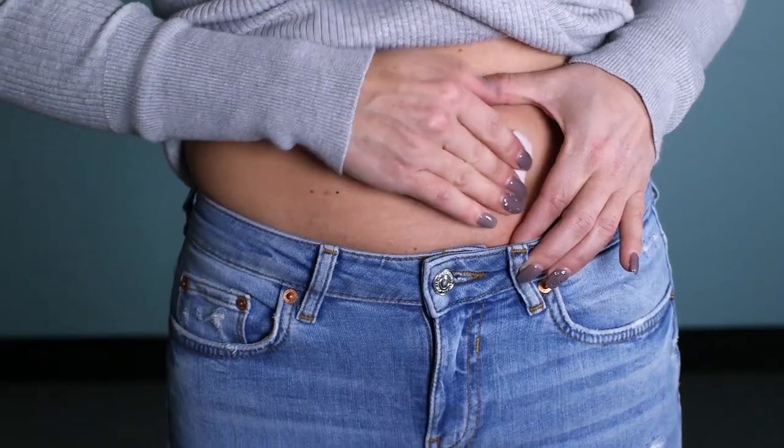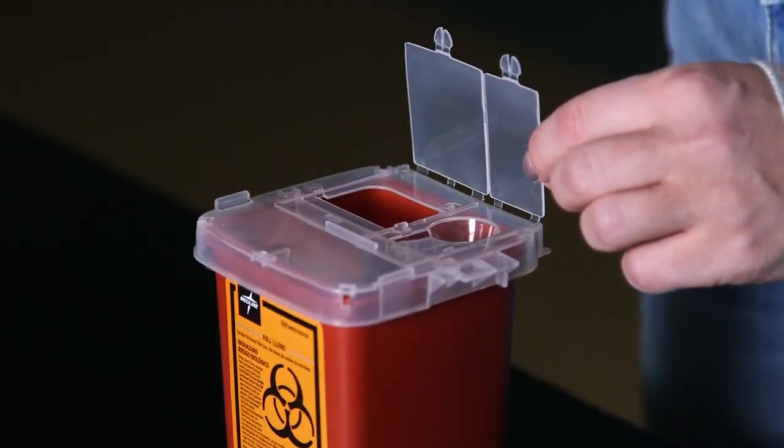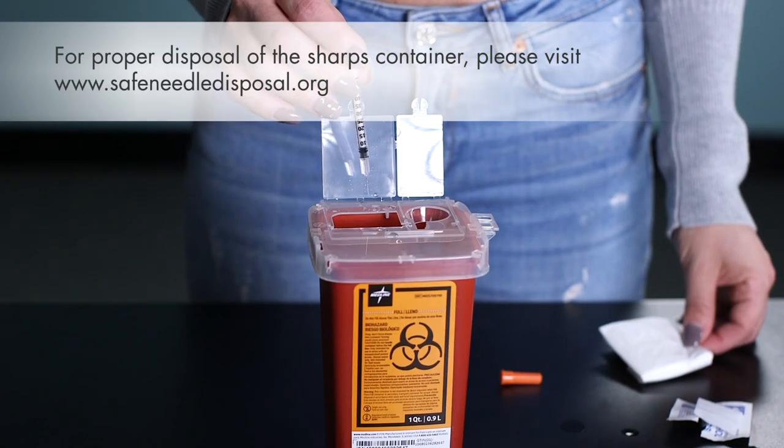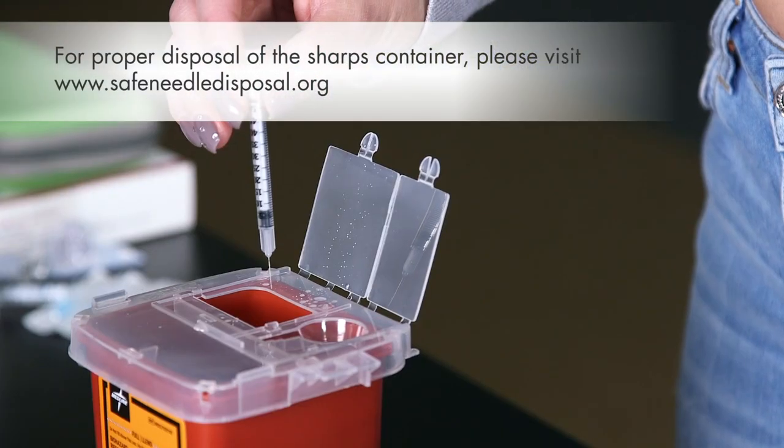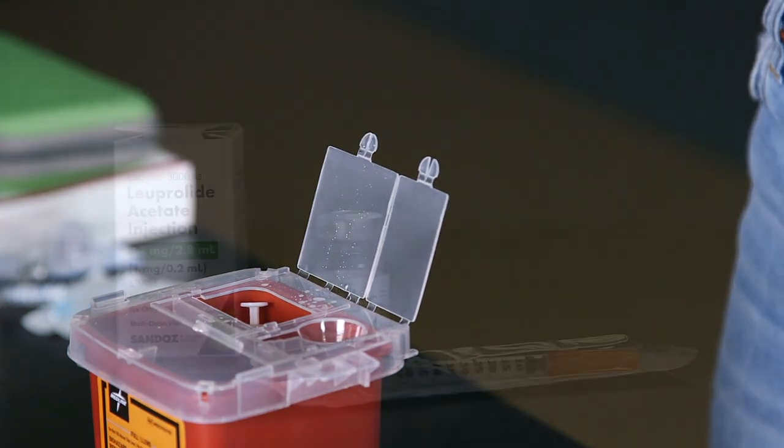Use a gauze or a tissue if there's any bleeding. The sharps container comes with a permanently sealable top. Open the lid. Do not recap the needle — just drop the syringe into the sharps container. You can close the lid, but do not seal it until it's full.